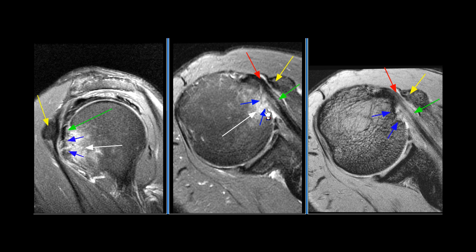There is narrowing of the coracohumeral space between the coracoid process and the humerus. There is severe subscapularis tendinosis with partial tearing of the inferior fibers at the humeral insertion. Bone marrow edema is seen in the lesser tuberosity with cortical erosions.